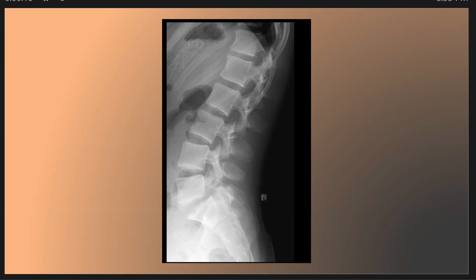This is a new short case discussion. This is a patient, a teenager, with lower back pain. As we see here, this is the lateral view of the lumbar sacral spine.